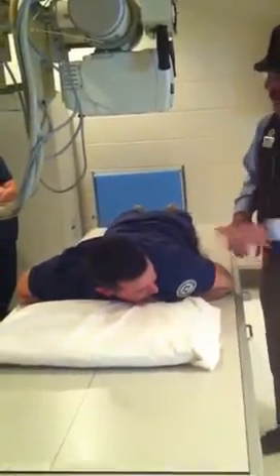right lateral skull. So what I want you to do is put this arm down by your side. I want you to put this hand here, that's fine. I want you to roll your hip up, bring this knee out just a little bit. Okay, that's good. So notice we put the body, the patient's body, in that 45-degree oblique position. Okay? This grossly facilitates him being able to position his head appropriately. Okay?